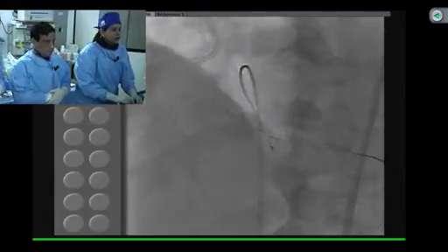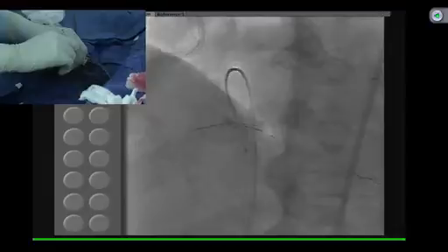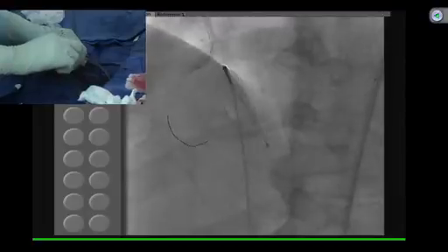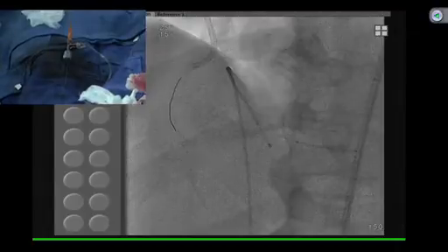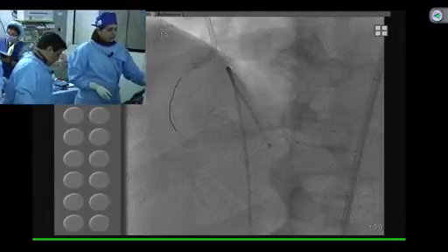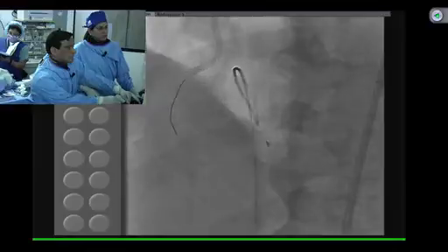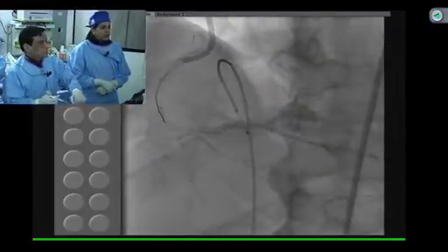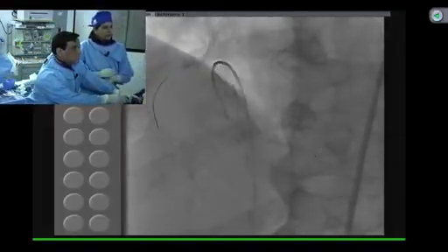So before you deploy your other wire, you cannot trap that, and it is very common that when you are pulling your second wire, if you see what has happened, the stent got pushed forward because of the inertia maintained in the vessel since we are trying to go forward. The other important point in this kind of bifurcation, where you are trying to put the third stent through 2 or 3 layers of stent, is that as an operator you need to pay attention that this stent can start stripping off. So you have to be very careful how much push-pull technique you are doing, and be aware that a stent could be stripping off in this kind of situation.